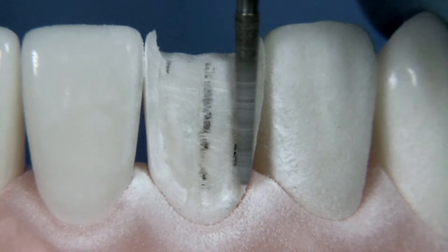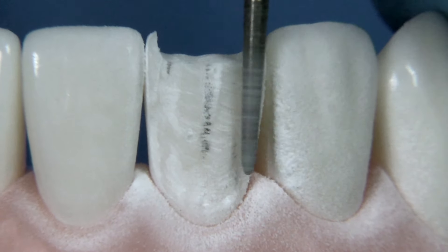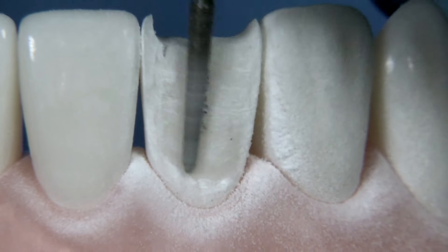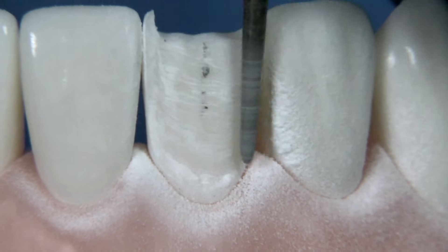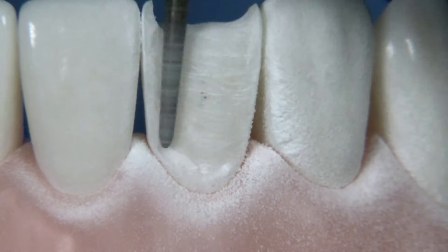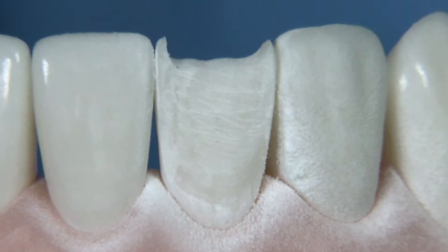Another approach is the plane reduction technique I've taught in many other videos, but whatever technique you want to use, just make sure you can measure what you've taken away versus what you started with and also where you're going. The whole idea of the stent is to show you how much tooth structure to remove based on where you want your final veneer to be located.